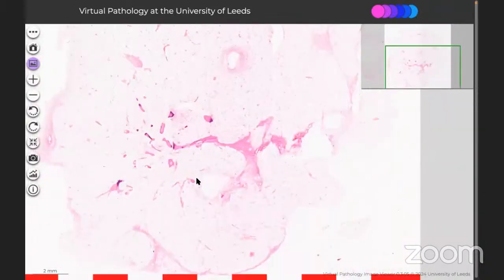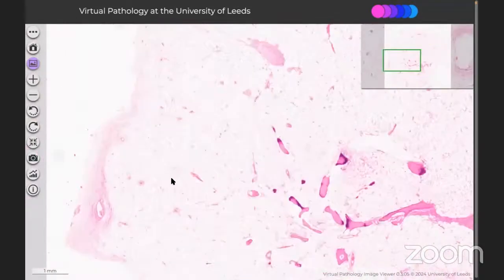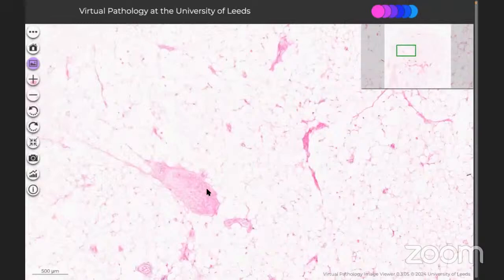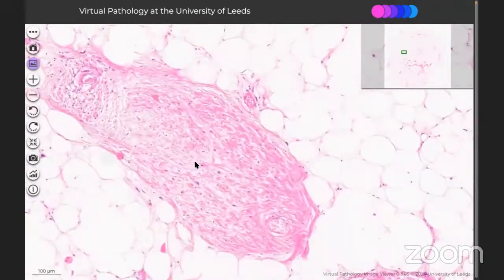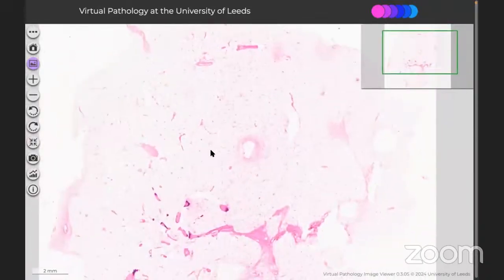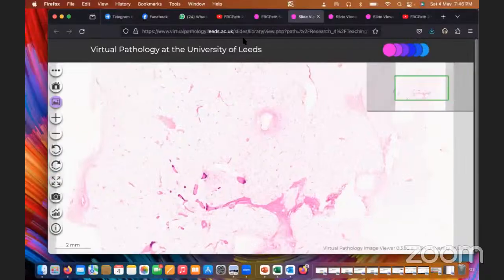Okay. And the case is to be referred to a sarcoma referral center, where further management guidelines will be given, and depending on the margin status, they can follow up with radiotherapy per se. Okay, so this is how you complete the station, and this is a good example of well differentiated liposarcoma, and you should look for a dedifferentiated area per se. Okay.